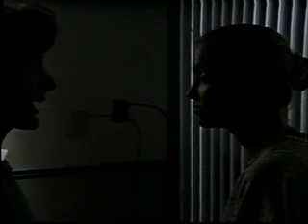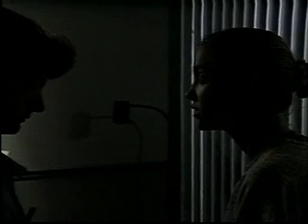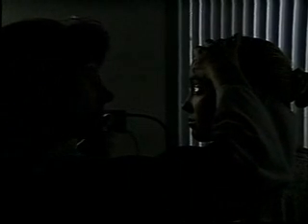After darkening the room, ask the patient to look over your left shoulder at a specific spot on the wall. Using your left eye and left hand, examine the patient's left eye. From 15 inches away and 15 degrees lateral to the patient's line of vision, shine the light beam on the pupil.